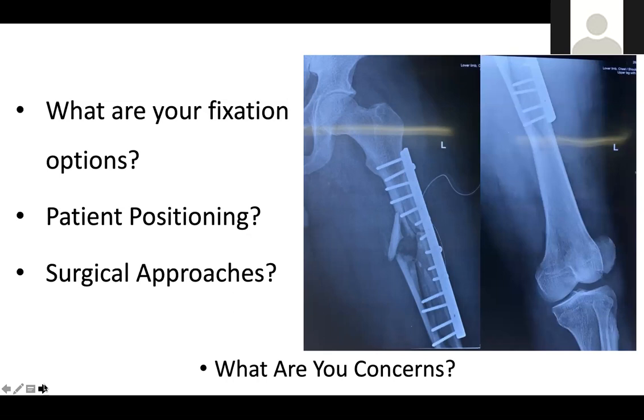In addition to the biomechanics resulting in bending of your plate, this implant may also have very little pull out strength. You may find that even before your plate bends, all your distal screws pull out, because there is no good cortical purchase. The majority of them are going into the fracture.